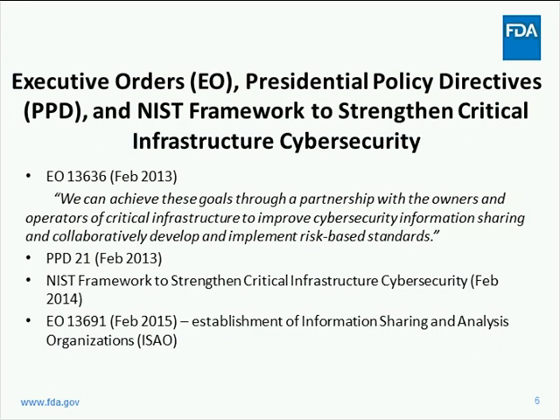device and healthcare cybersecurity. It was this executive order in February 2013 that further directed the creation of the NIST framework for critical infrastructure cybersecurity, with Department of Homeland Security charged with spearheading its adoption across all sectors of critical infrastructure. To further deploy the concept of information sharing for cybersecurity, another executive order was issued in February 2015, and that called for the establishment of Information Sharing and Analysis Organizations, or ISAOs for short. Efforts have been ongoing across the U.S. to further characterize what an ISAO would be, how it would work, and what protections it would afford.